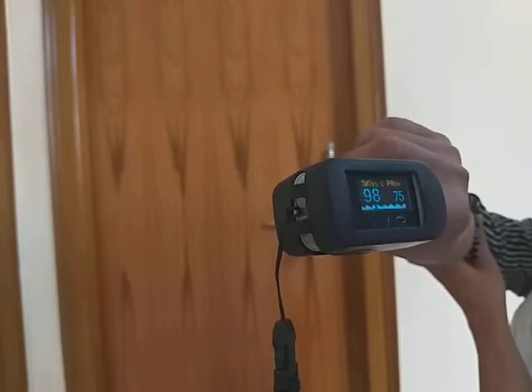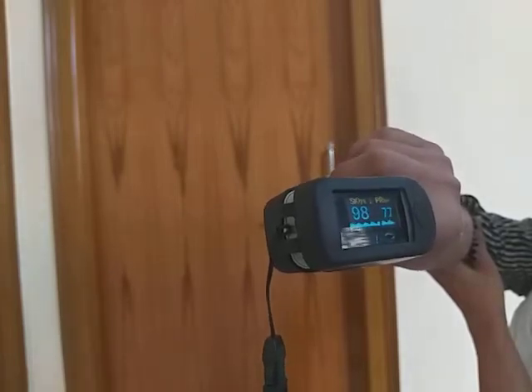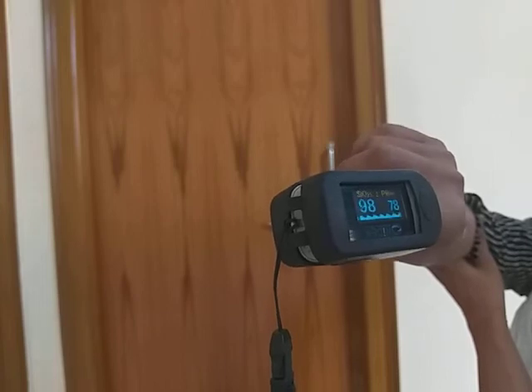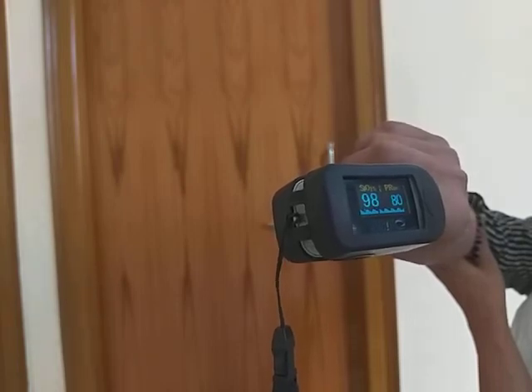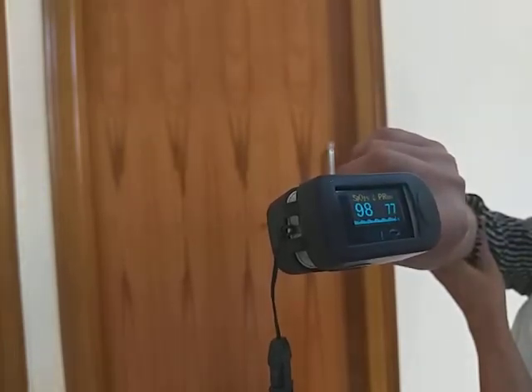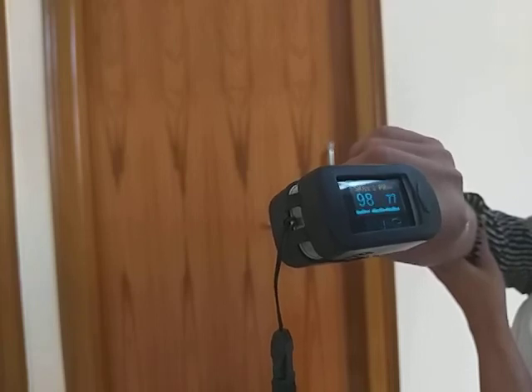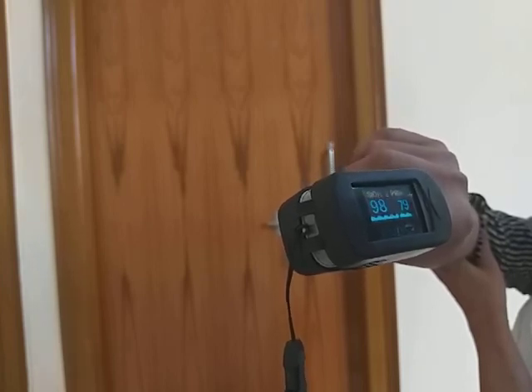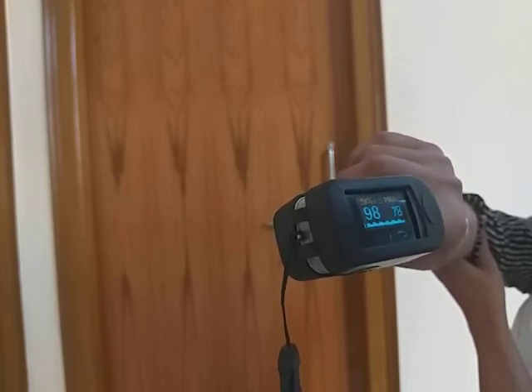If the desat max increases over time, that is an ominous sign and the patient should contact a doctor or hospital emergency. We have already crossed 1 minute 20 seconds and her saturation is 98% with normal pulse rate — she has a perfectly normal two-chair test. If a COVID patient shows progressive desaturation, that is concerning, but if desaturation is improving — a dip of 10% now coming down to 8% or 6% — the patient is recovering. Thus one can assess the course of the disease using this simple test to understand whether the disease is progressing or recovering. You may try this at home.